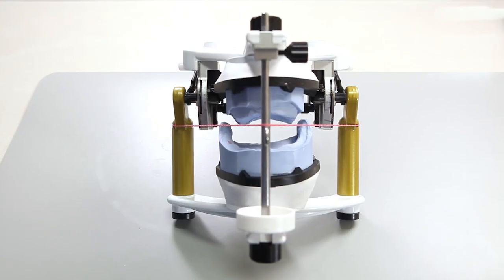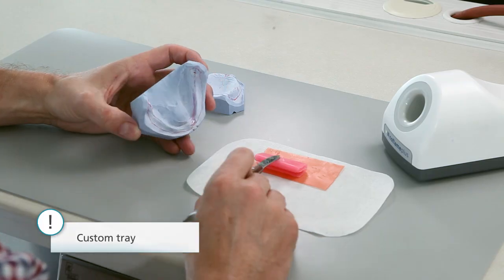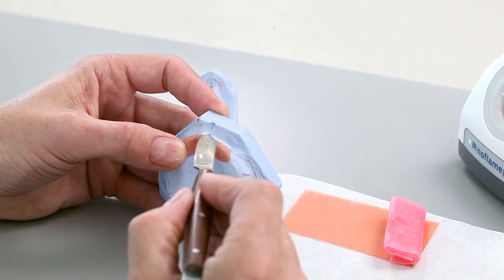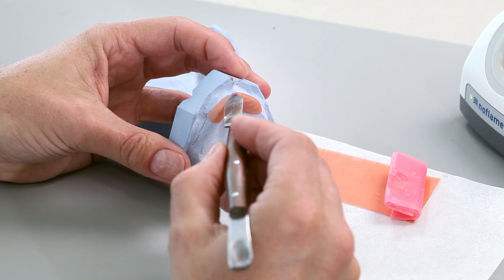The models are already aligned as required, taking the temporary vertical dimension, the retromolar pad, as well as the anatomical midline into consideration. Carefully block out the undercuts with wax. The maxillary model can be blocked out with wax in the area of the palatine rugae so that the impression is as detailed as possible.